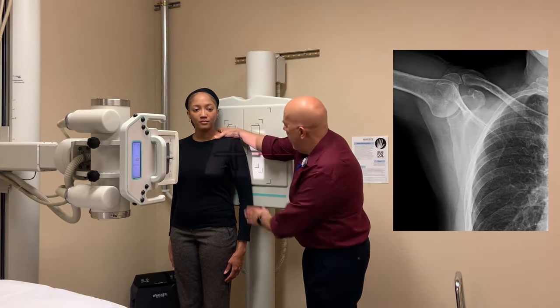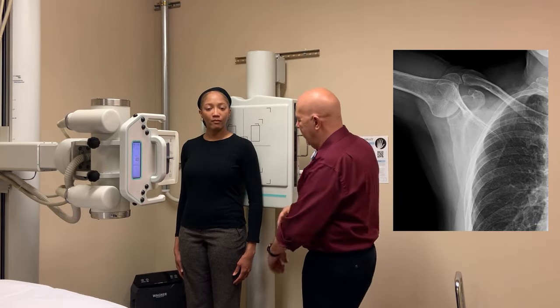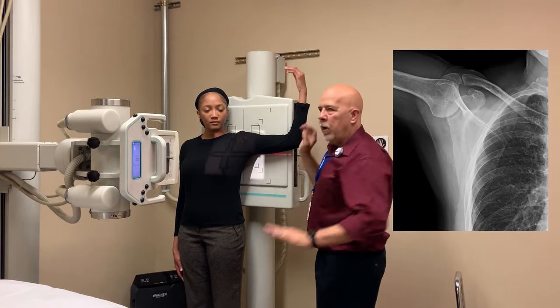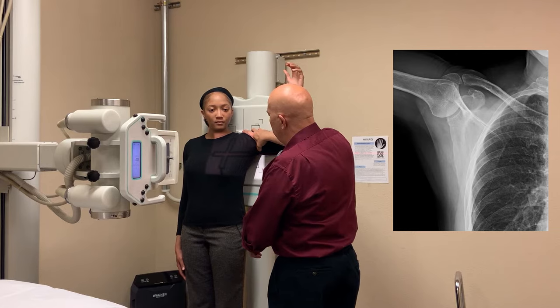So for the AP, we're going to have the patient come this way just a little bit. You want to center to the mid-scapular region, so you're just going to have to kind of estimate that. You'll have to place the hand up like this — sort of like you're saying stop. You want to center the mid-scapula, give it this way just a little bit.